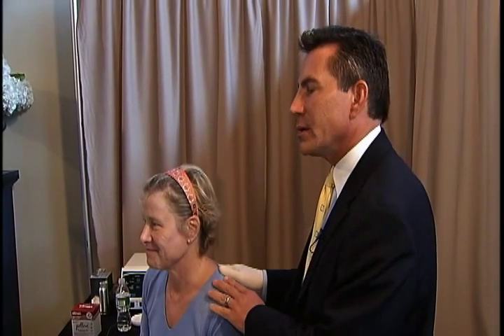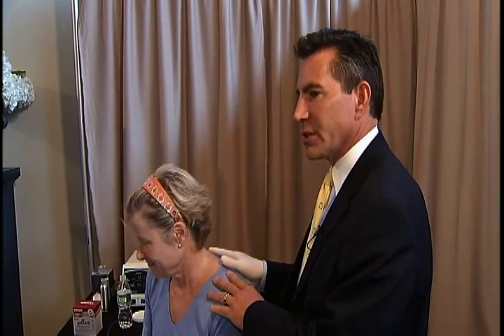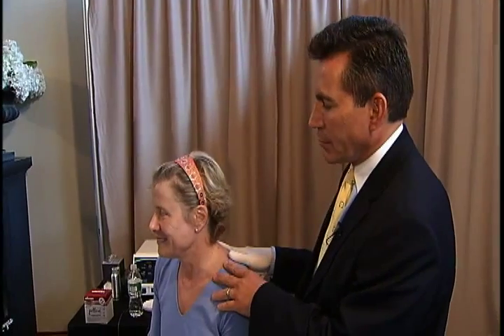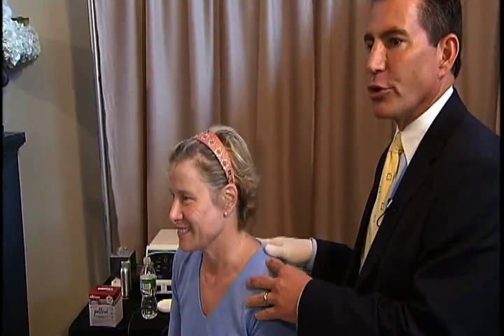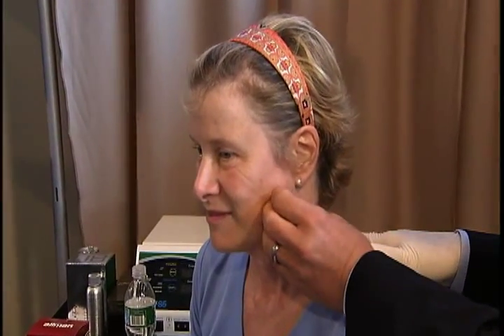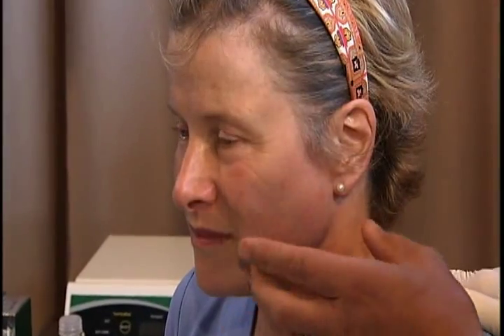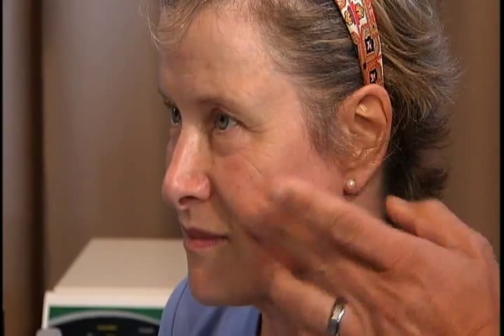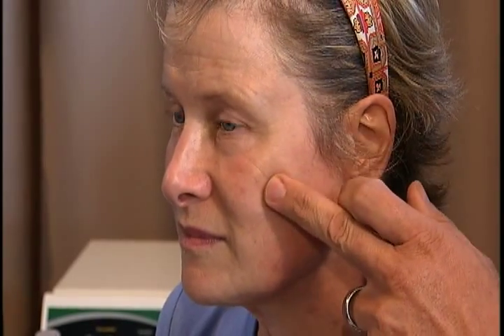Okay, so Mimi is our first subject today, and she has a lot of things that will improve. She has great skin, this vellus hair and elastic type skin, really responds well. She has just really early softening, so she's had flattening here in the zygoma to cause descent of the cheek, to cause the nasolabial fold to start forming, some wrinkling in the forehead and crow's feet area.